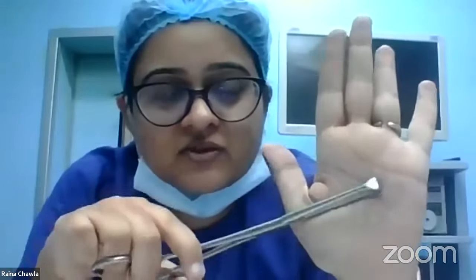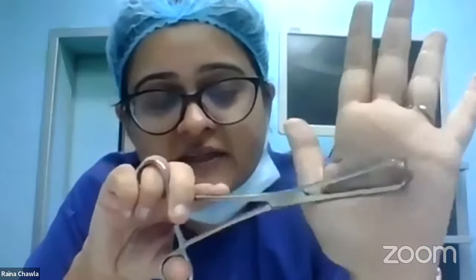Okay, this is an Allis forceps. Can you see clearly? It has a small triangular end, and it has serrations at the end. So it's slightly traumatic. It has small teeth, which are not very visible here, but this is an Allis forceps. An Allis forceps is used to hold tough structures, like the rectus sheath. When you're opening the abdomen for, say, a cesarean or a hysterectomy, you hold the rectus sheath with this. You hold the angles of the uterus. So I will limit myself to gynae surgeries and obstetric surgeries.